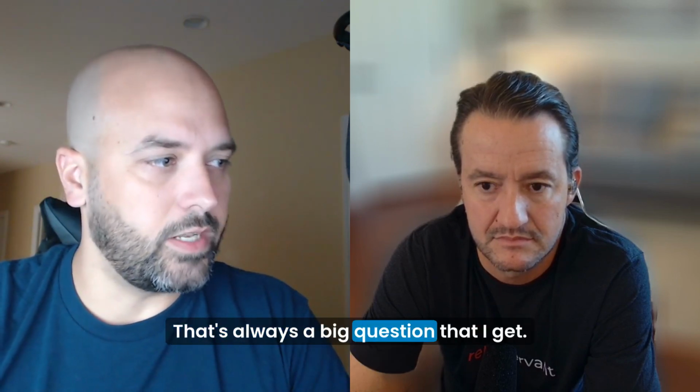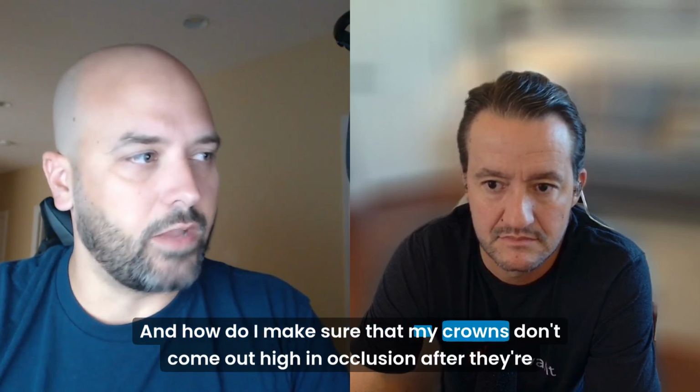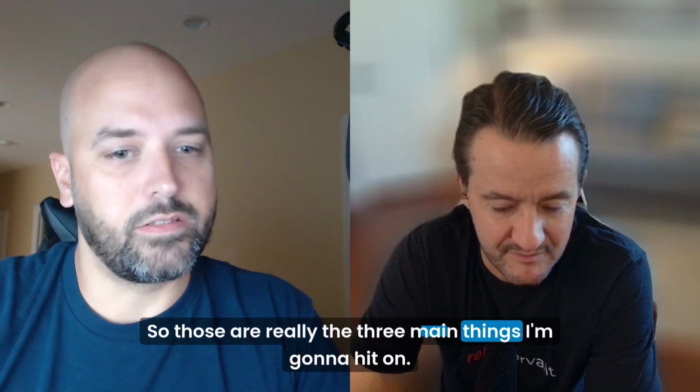And then the last issue is contacts and occlusion. That's always a big question that I get. How do I dial those in? And how do I make sure that my crowns don't come out high in occlusion after they're milled? So those are really the three main things I'm going to hit on.